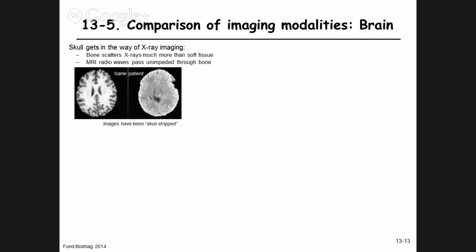Okay, which one is what modality? What modality do you see on the left? MRI or CT? On the right, is it CT or MRI? Anybody dare an answer? Okay, who thinks on the left it's MRI? Who thinks it's CT? Who thinks on the right-hand side it's MRI? Who thinks it's CT? Who thinks it's SPECT or PET? Okay, how can you tell on this image?